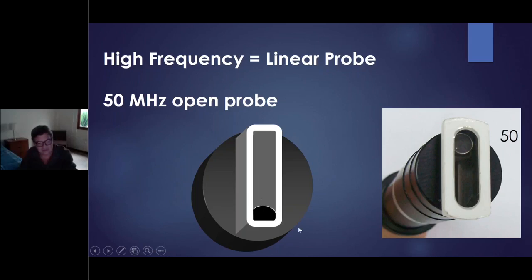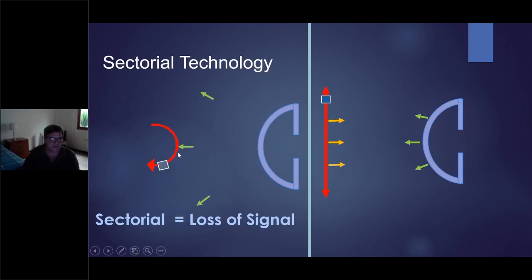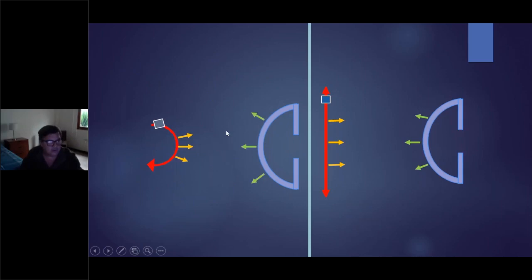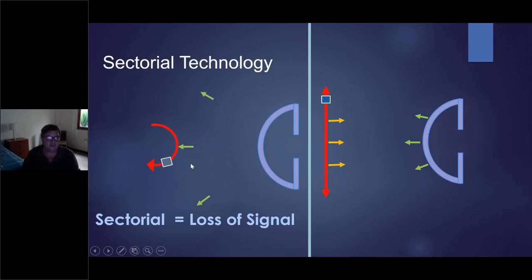Why? Normally you have sectorial technology. With sectorial, you send the echoes, but when the echoes go to the cornea and the anterior segment, they come back. Not all the echoes go back to the transducer. Most of them, because it's a spherical surface, you lose. And because the probe only has this movement, the only way you can get a perpendicular image is just in the center. In the periphery, you have distortion. This is the sectorial UBM probe.